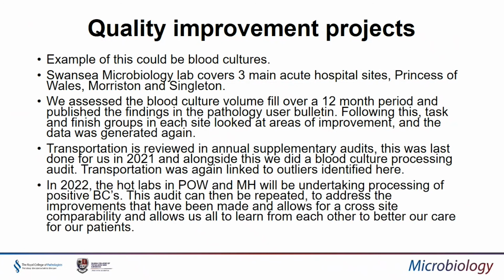So in 2022 we opened hot labs, and we do have one now in Princess of Wales and in Morriston. As a new quality improvement project, all of the hot labs are now going to be processing positive blood cultures. It's a really good opportunity for us now. We can repeat the blood culture processing audit in all of the sites.